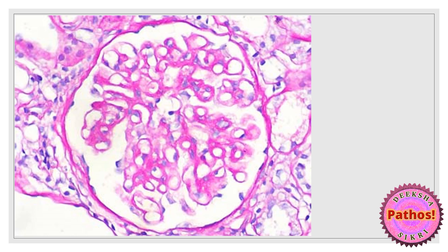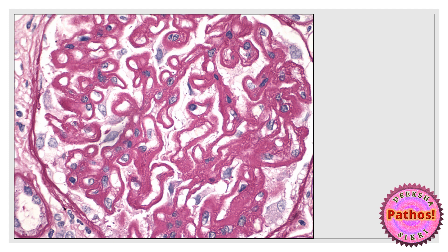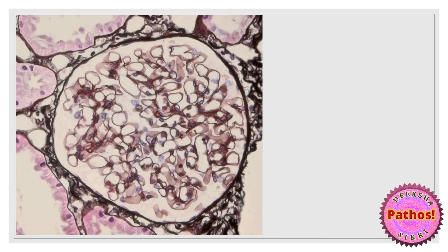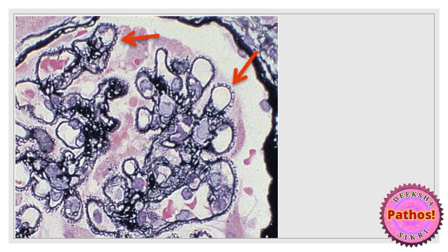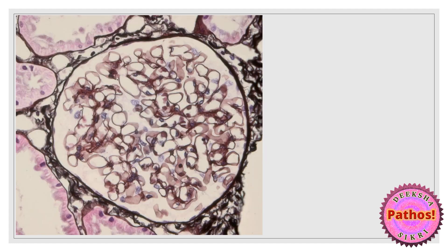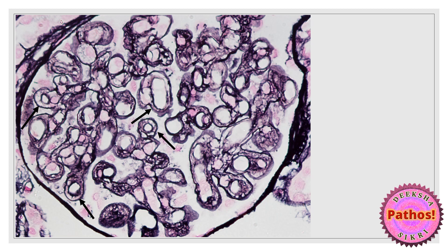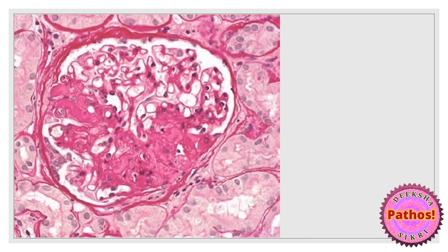Normal PAS stain, then look at this — it looks like someone took a thick pink sketch pen and highlighted the basement membrane all over. So this is a thick basement membrane on PAS stain. Silver stain normal, then look at this: the red arrows show something perpendicularly protruding from the capillary basement membrane. Then another abnormal: the arrows show the capillary basement membrane is not one but two — double basement membrane. Remember this photograph.